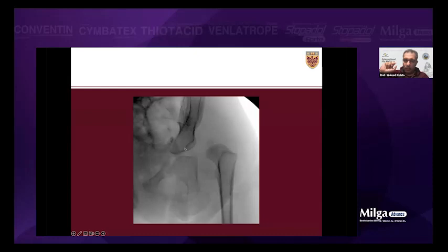In Egypt you call it gallbladder, Dr. Muhammad. Okay, use a gallbladder forceps. So I used two of them. So I start to use them.